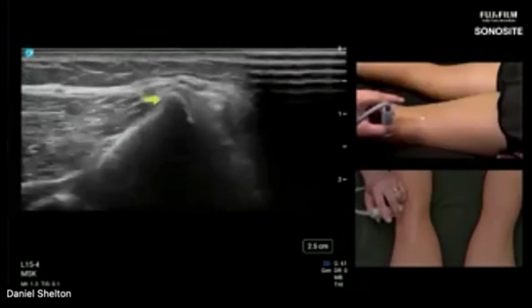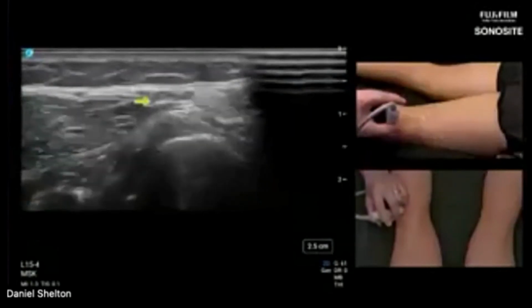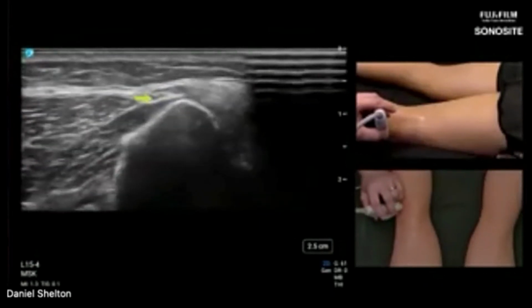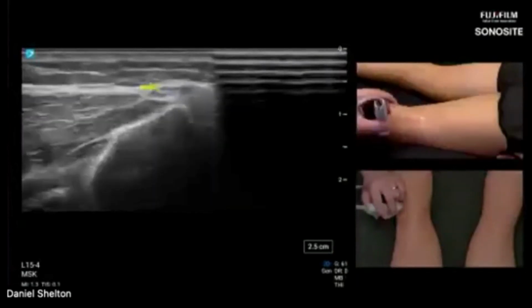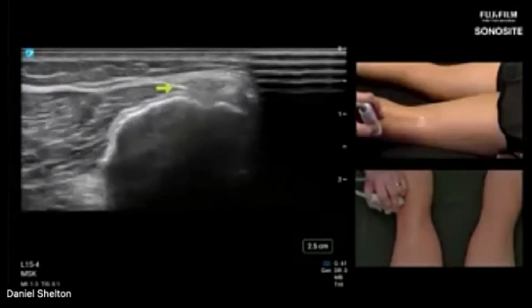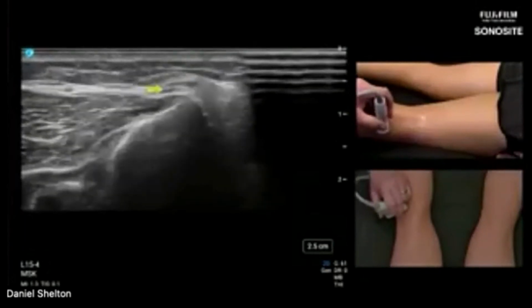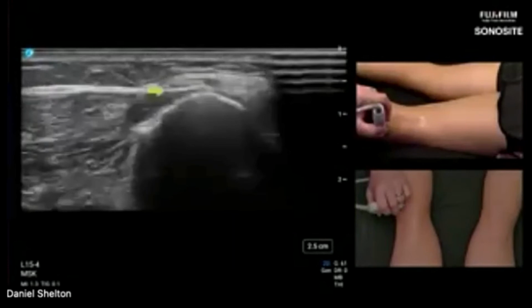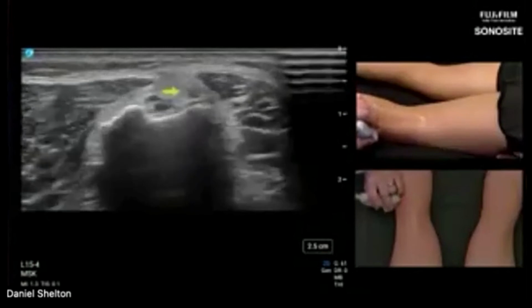And in our model's case, that nerve is already sitting perched. You just saw that little subluxation there that happens. Crossing your knees when you sit, that's a terrible way to sit, and it can make that nerve sit in an unnatural place, kind of like we just saw the subluxation. I'm going to force that back over the fibular head, and we're just going to watch that snap there. So it's very mobile, and you can see why when you cross your legs, when you sit, cross your knees, that nerve might get pinched on the fibular head and then neck.